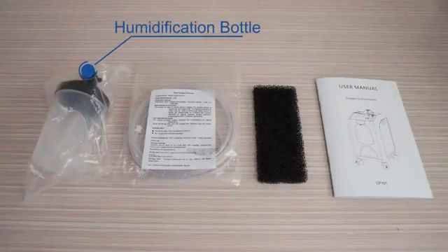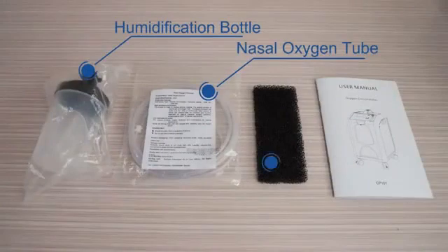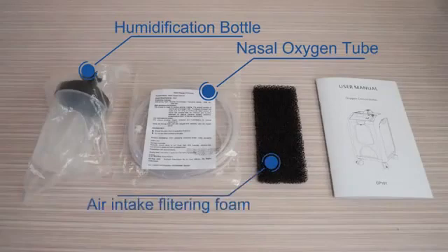The accessories include: humidification bottle, nasal oxygen tube, air intake filter foam, and user manual.